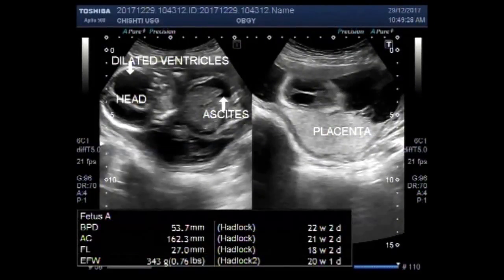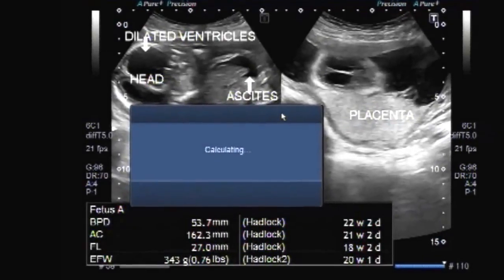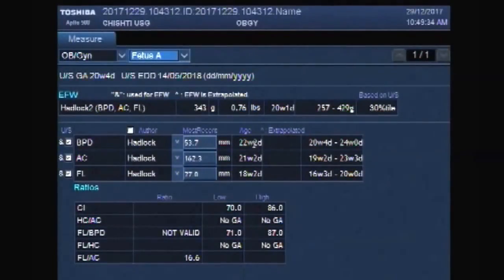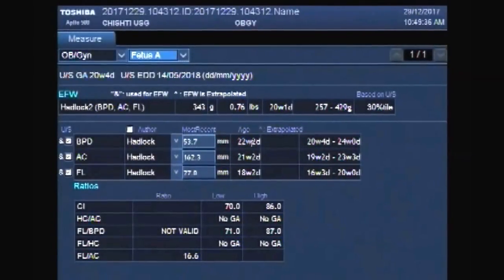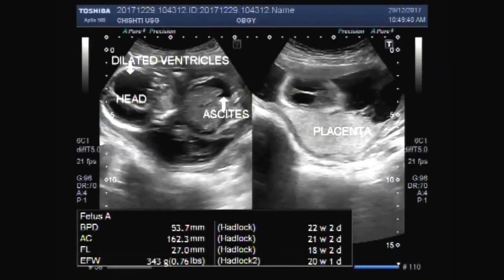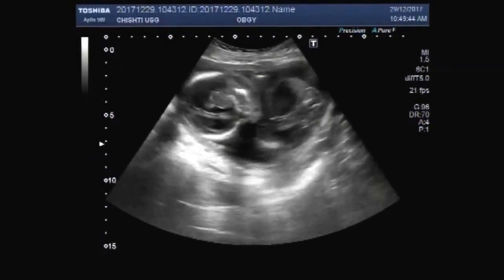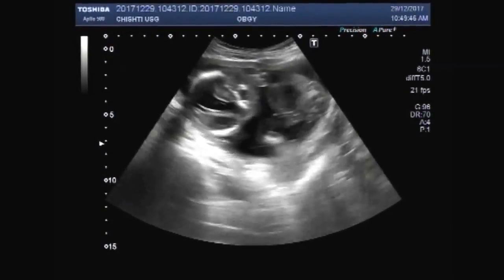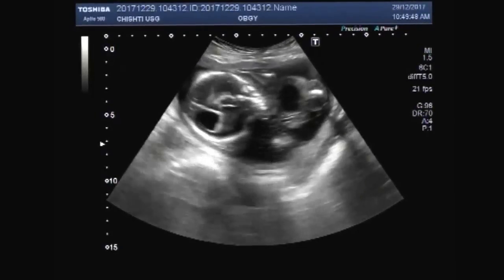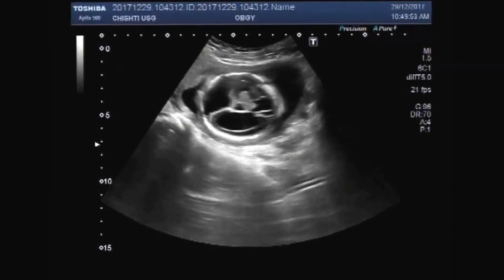Dear viewers, I hope you are all fine. This ultrasound video shows a fetus of about 20 weeks having dilated brain ventricles, fetal ascites, and an encephalocele attached to the hind portion of the fetal head.